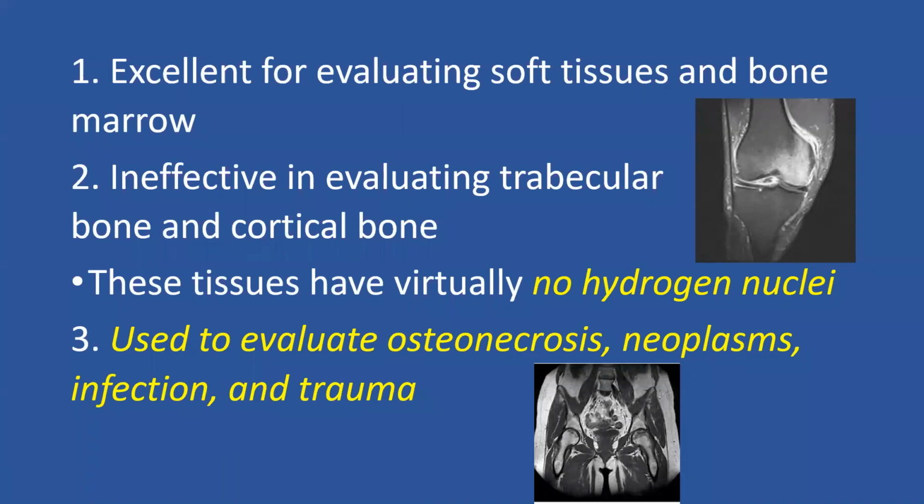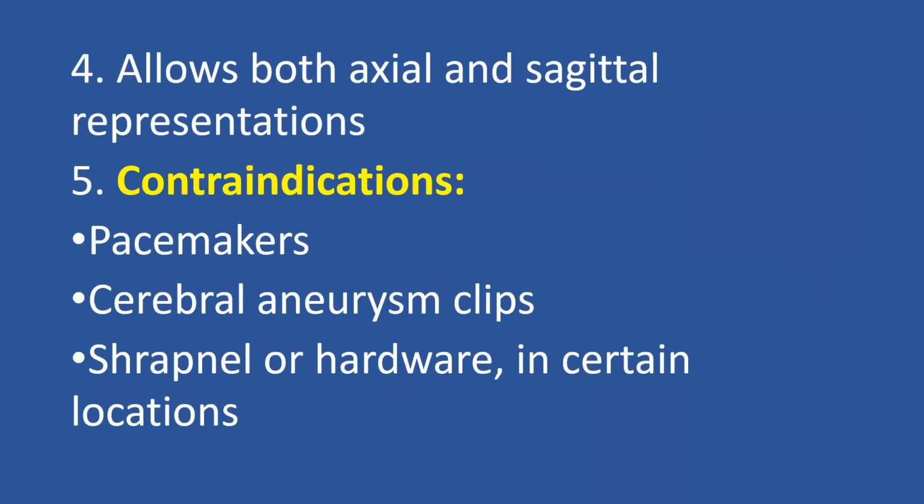It's used to evaluate osteonecrosis, neoplasms, and infection. And don't forget about trauma. It allows for both axial and sagittal representations, but has its contraindications: pacemakers, cerebral aneurysm clips, shrapnel, or hardware in certain locations.